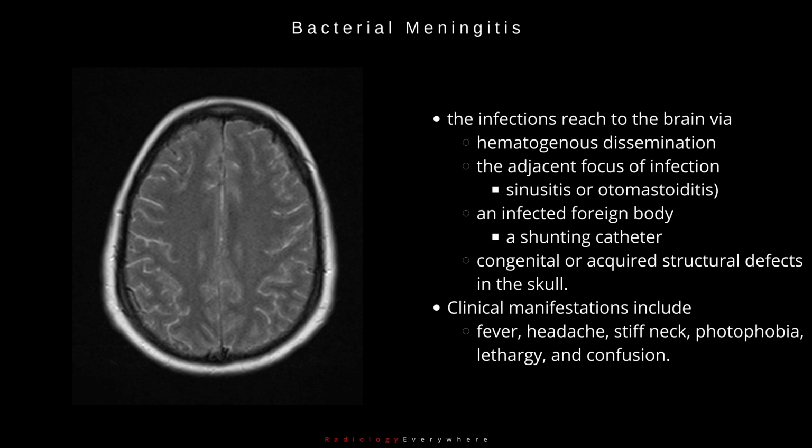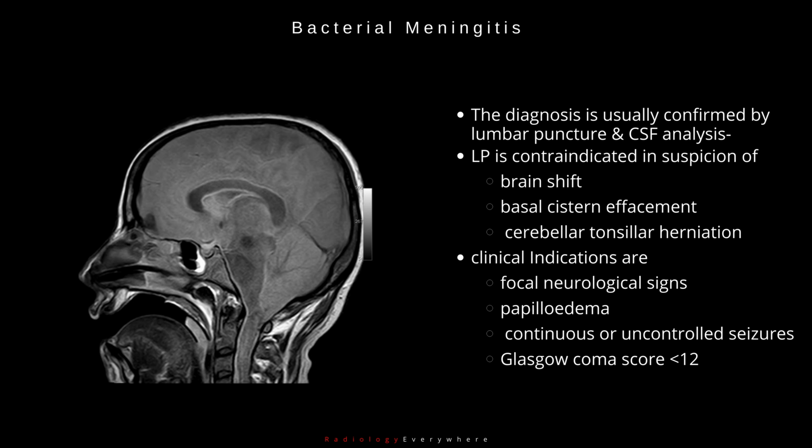Clinical manifestations include fever, headache, stiff neck, photophobia, lethargy, and confusion. The diagnosis is usually confirmed by lumbar puncture and CSF analysis. If LP is contraindicated in suspicion of brain shift, basal cistern effacement, and cerebellar tonsillar herniation, CT is indicated.